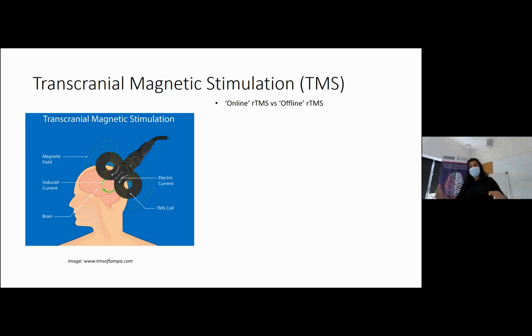During each trial, there's the effect of pulses being given, which can be a source of distraction, for instance. But if you're interested in how certain regions come together and create certain behaviors, or in the mechanistic modeling itself, then online rTMS methods might be the way to go.